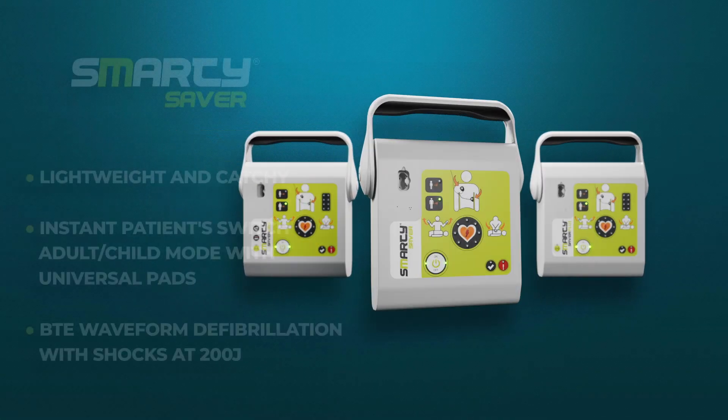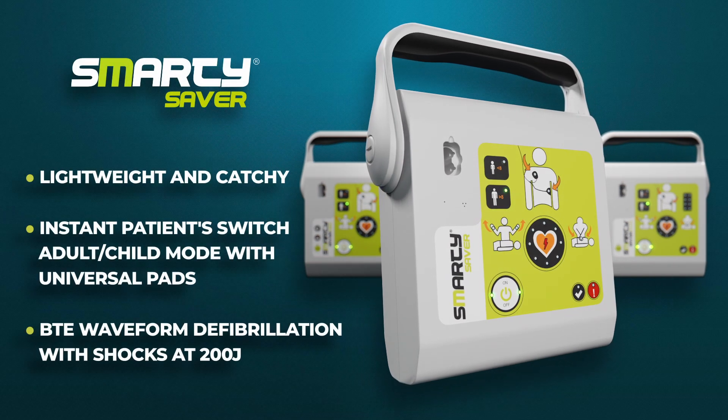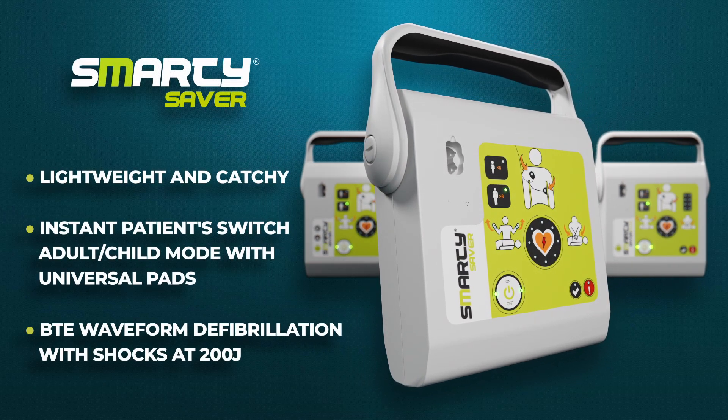The Smarty Series consists of three main devices, each with different, unique features.